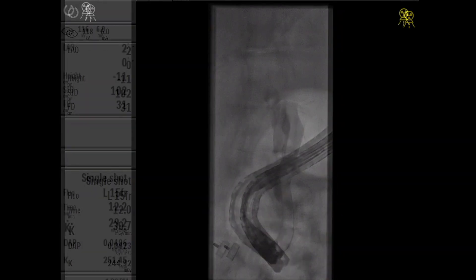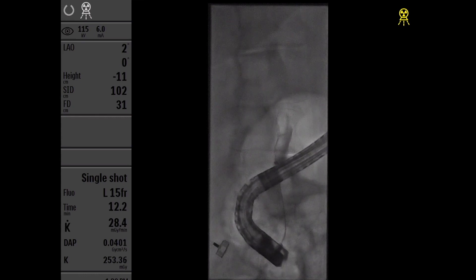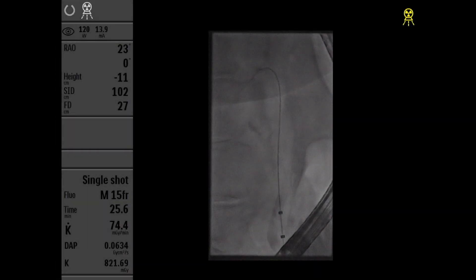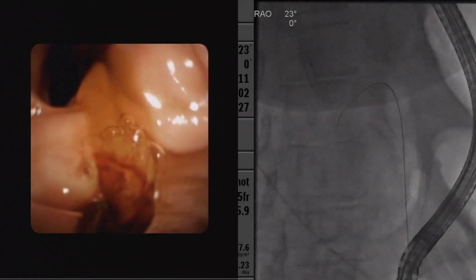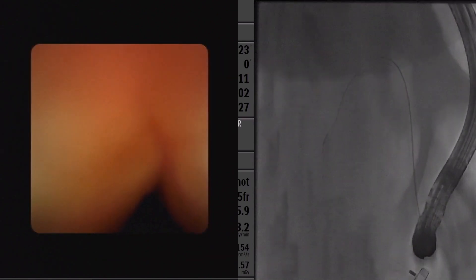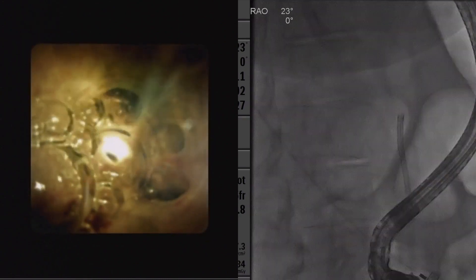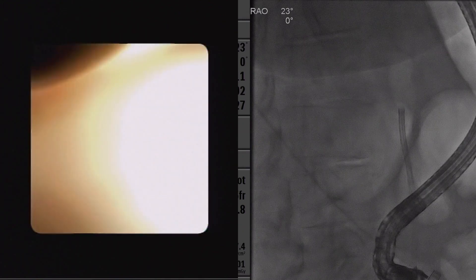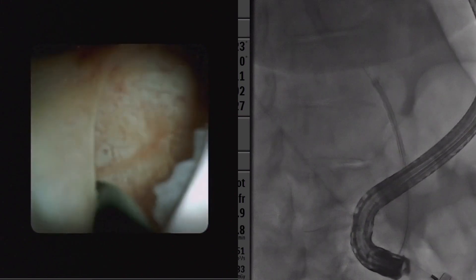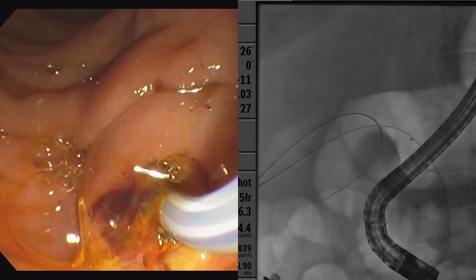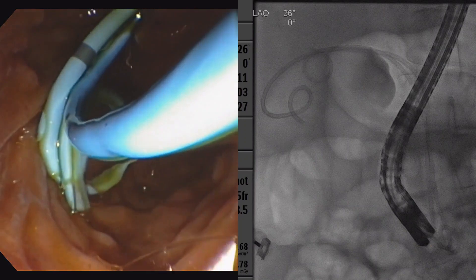In this case, the cystic duct was identified on fluoroscopy but cannulation was unsuccessful despite multiple repeated attempts. The decision was then made to proceed with direct peroral cholangioscopy. While this device does add cost to the procedure, successful drainage of the gallbladder was felt to be critical in this patient with limited alternative options. The cholangioscope was advanced alongside the guide wire until the cystic duct takeoff could be identified distal to the hepatic bifurcation. The cystic duct could then be partially intubated with the cholangioscope, and a wire passed under direct visualization. Facilitated by fluoroscopy, the wire was advanced through the cystic duct and into the gallbladder. The cholangioscope was then withdrawn and exchanged for a dilating balloon. Dual wire access was then obtained and two double-pigtail plastic stents placed in parallel.